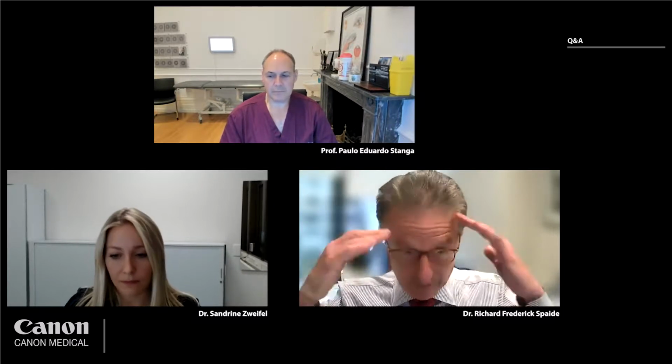And we're doing a lot of different studies actually on central serous currently. But if you understand the blood flow abnormalities, and there's some other structural things that I can't talk about yet because the studies are not done, I think it's going to change the way we think a lot about central serous. Once you have a better idea of the disease, the idea about how to treat it then becomes more obvious.